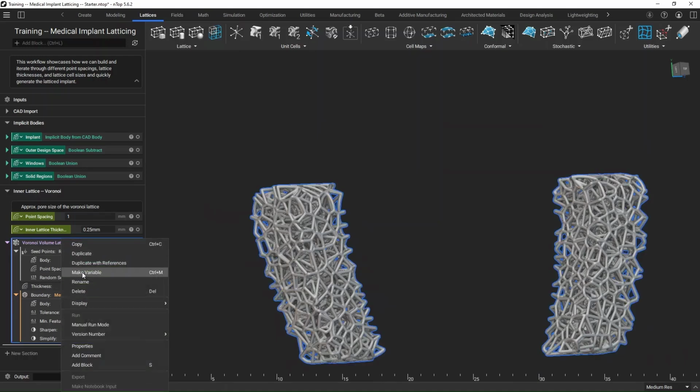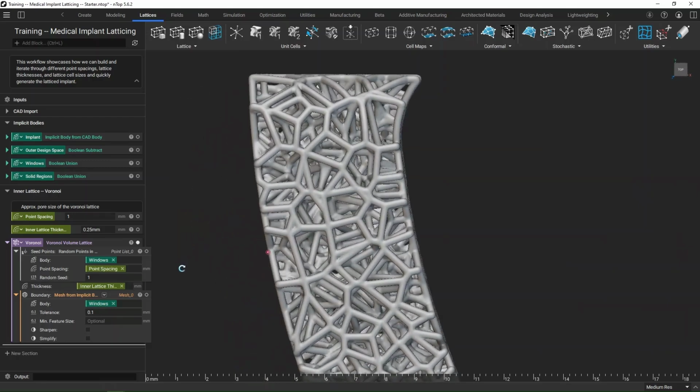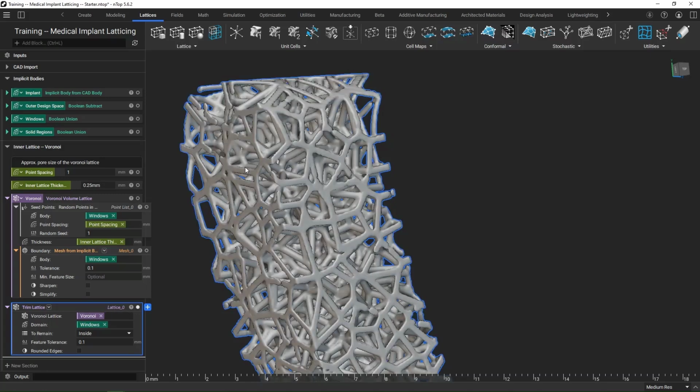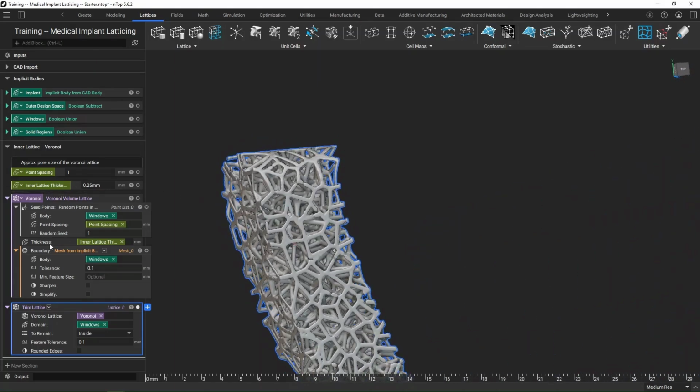So I'll go ahead, right click, make this a variable. So this is going to be our Voronoi. However, it does have rounded beams on the outside, which maybe that's preferred. Maybe we want to close it, contain it to our window. So I can go one step further, look up that trim lattice, where I can bring in that Voronoi. Again, bring in those windows because that's what I'm trimming things to. That 0.1 tolerance works just fine for me as well. And if I hit I to isolate that view, now we can see we've got that flat edge there to make sure it's just within the bound of those windows that we saw before.